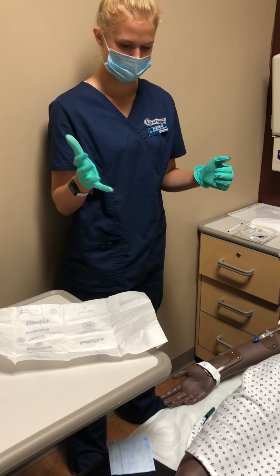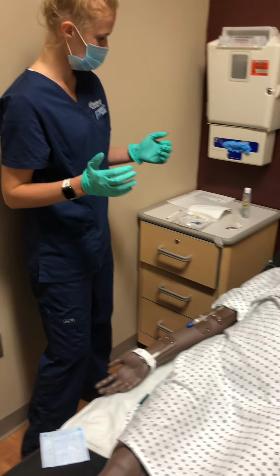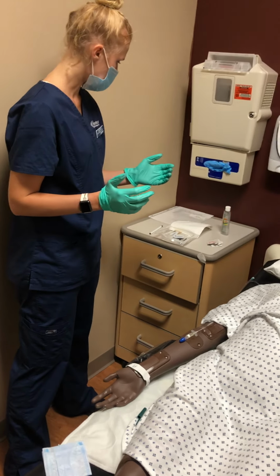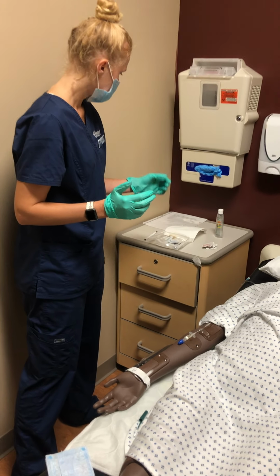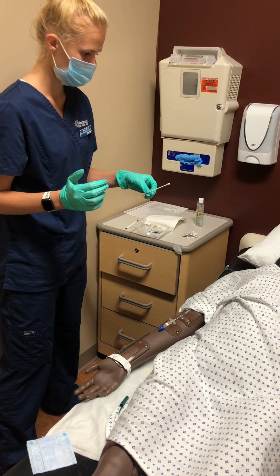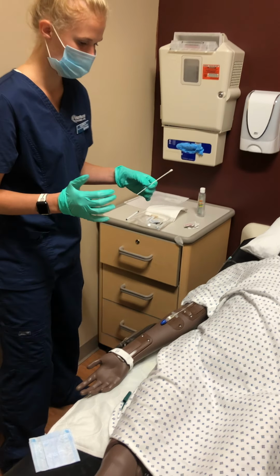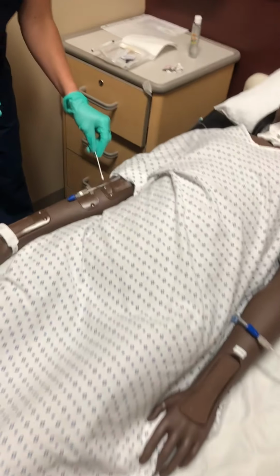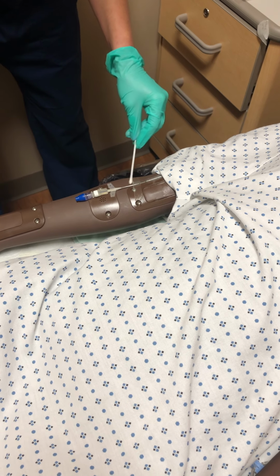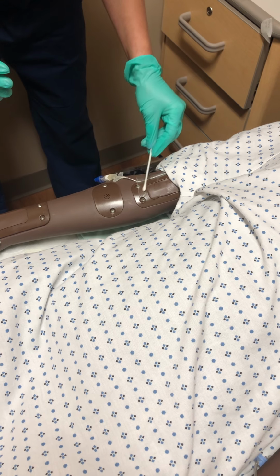Abducting your thumb the whole time. And then I'm going to go ahead and never turn my back to the sterile field. So now next what I want to do is grab... I would not touch the corner of that. You want to stay 2 inches within the line. And I'm going to go ahead and take out any of the drainage, start from the inside and go out for 30 seconds per agency policy.